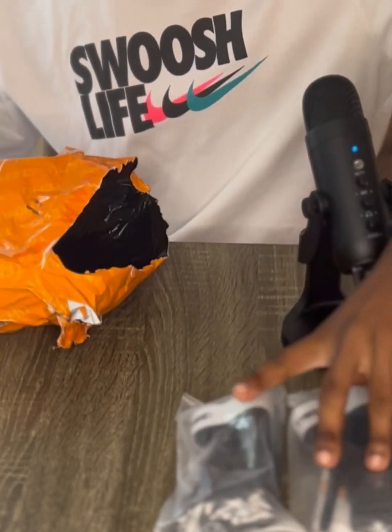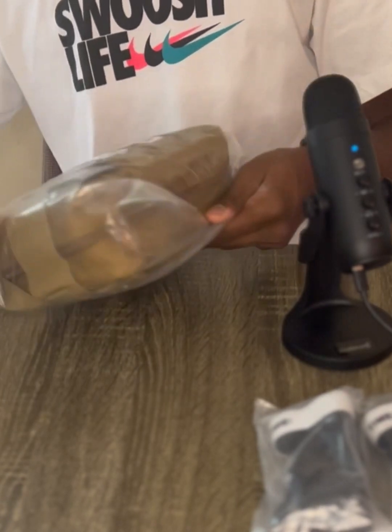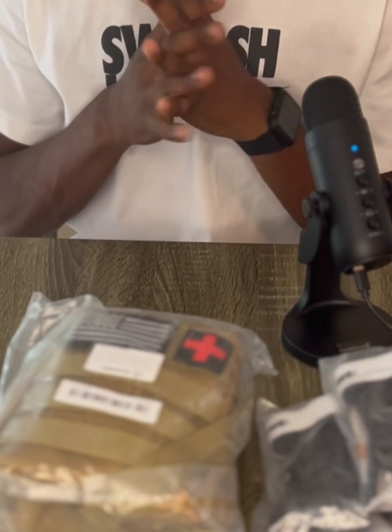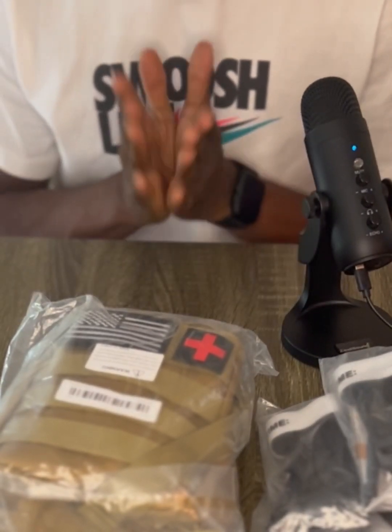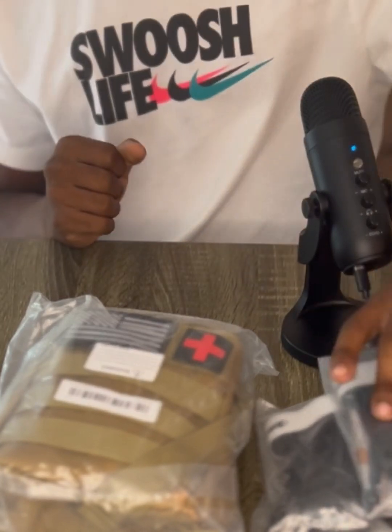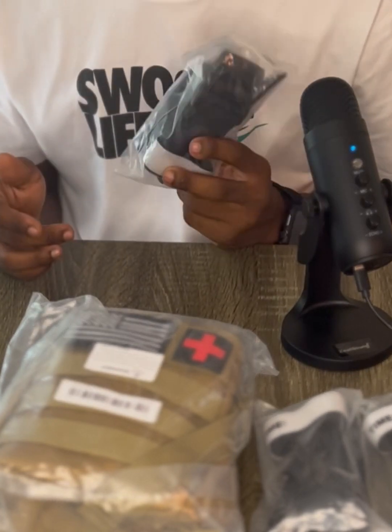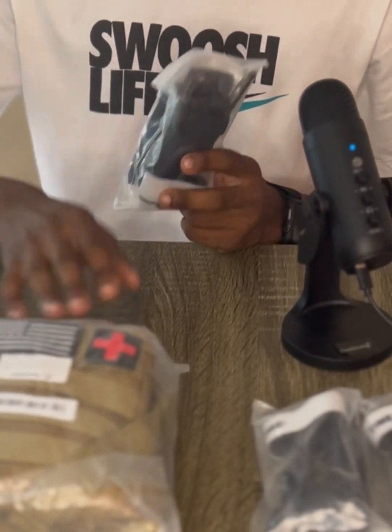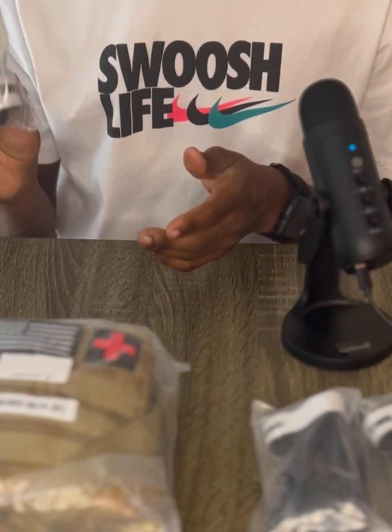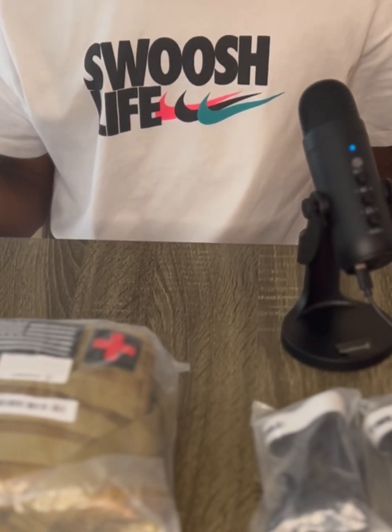First things first, I'm gonna take out the items I ordered. Here are some tourniquets — one, two — here's a first aid kit I ordered, and there's another tourniquet. First impression: one thing I always like about products is that they're individually packaged. Sometimes I like to leave them in the packaging, depending on what I'm about to do with them — like tourniquets, small stuff, sometimes I like to leave them in until I'm actually about to use them.